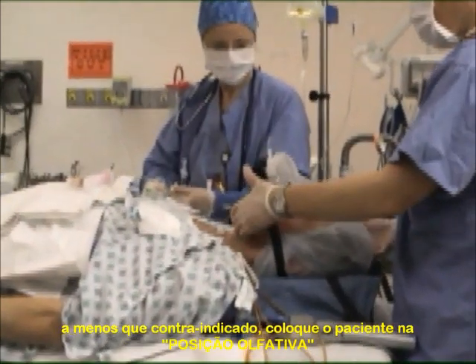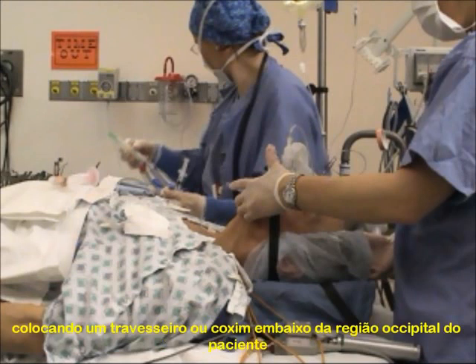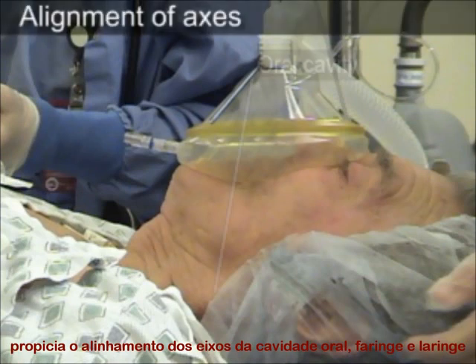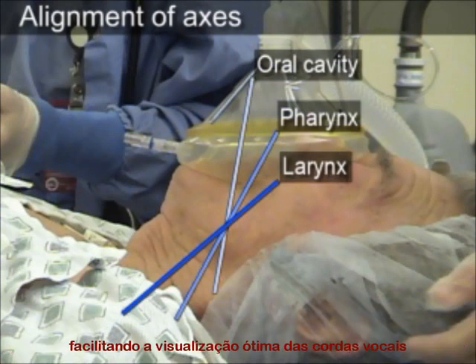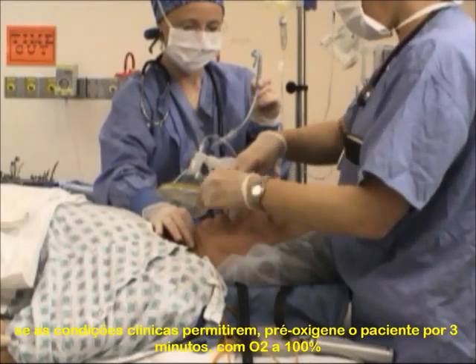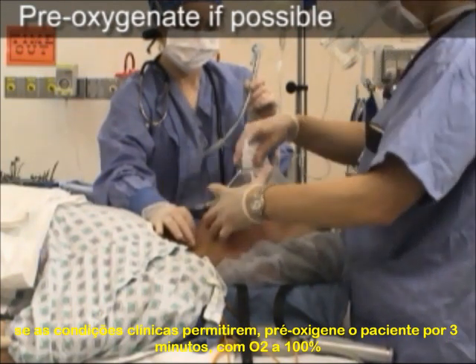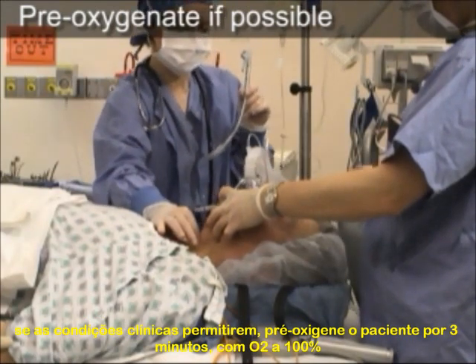Adjust the height of the bed so that the patient's head is level with the lower portion of your sternum. Unless contraindicated, place the patient into the sniffing position by placing a pillow or folded towel under the patient's occiput. This combination of flexion of the neck and extension of the head improves the alignment of the axes of the oral cavity, pharynx, and larynx, facilitating optimal visualization of the vocal cords. If the clinical situation allows, pre-oxygenate the patient with a non-rebreather mask or a bag valve mask with 100% oxygen for at least 3 minutes prior to the intubation.